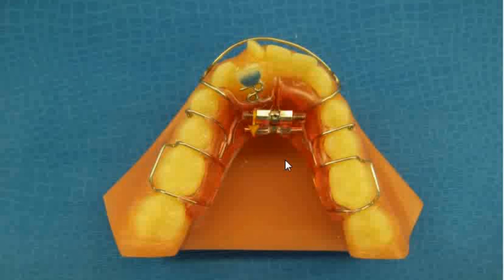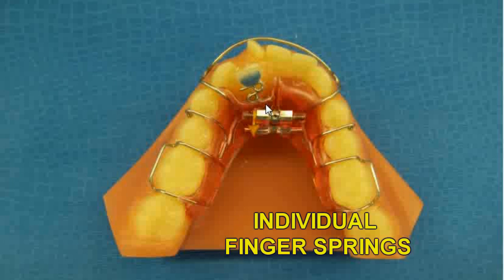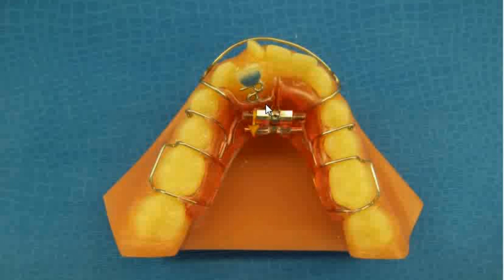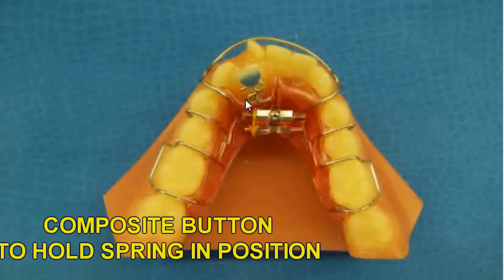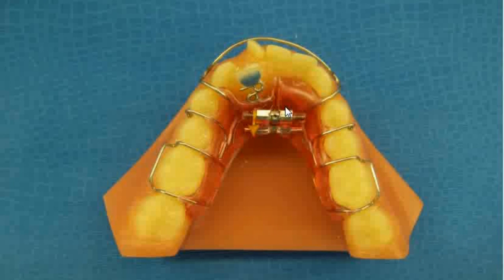In some cases, you may have one or more teeth that are too lingual or are very rotated. In these cases, you can put an individual spring directly on these teeth. The individual spring can help you provide a direct force on that tooth to get the movement you need. This spring can also be activated each month. You may want to place a composite button on the lingual of the tooth you're trying to move. This will help the finger spring to engage better and provide better movement.